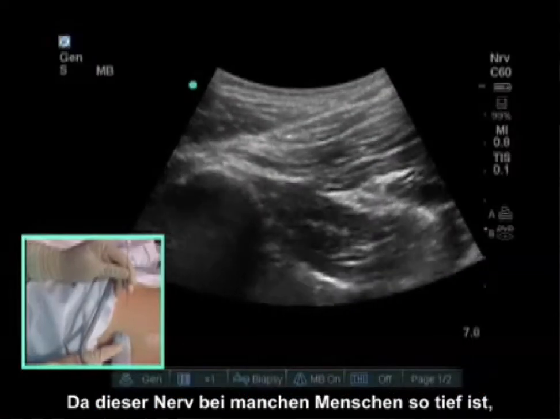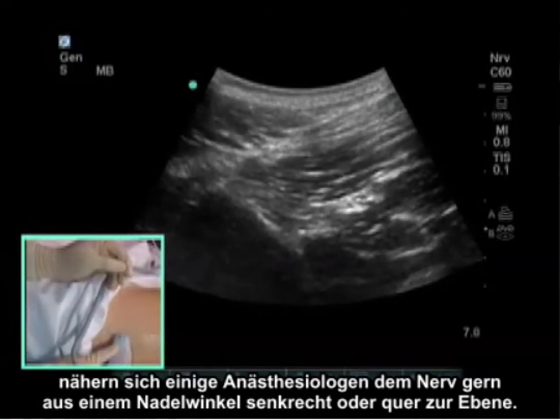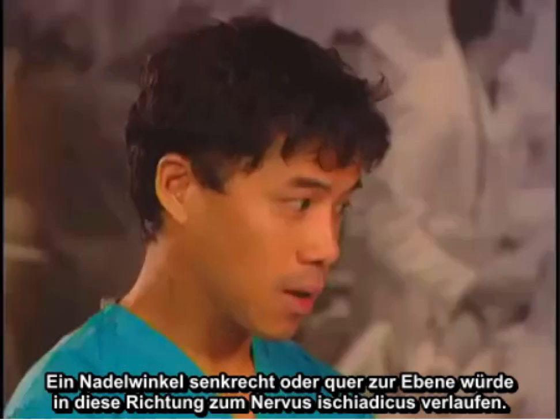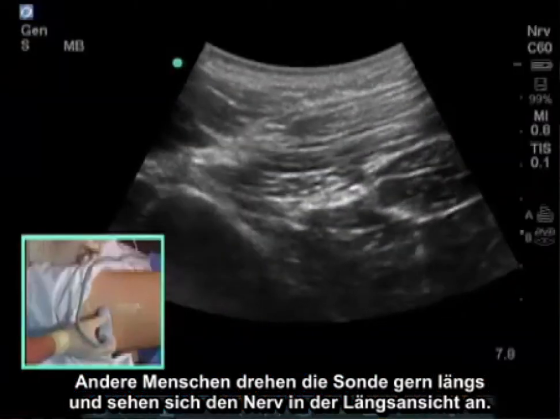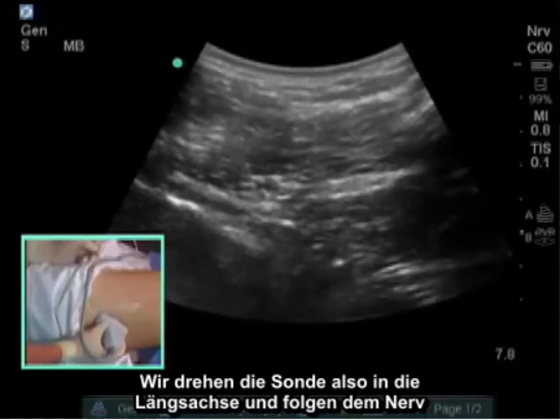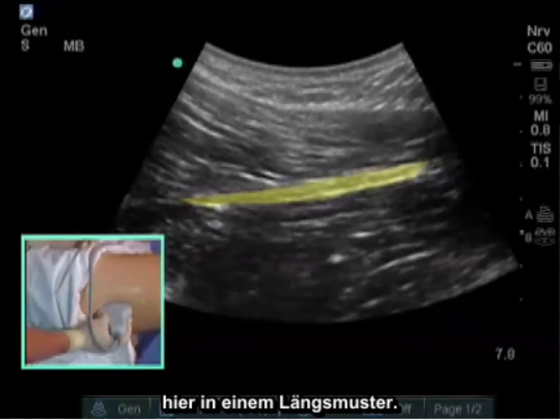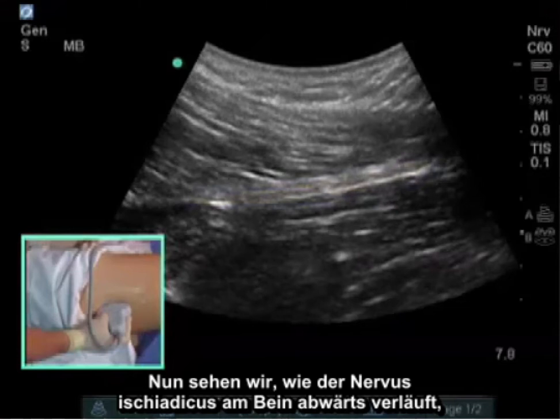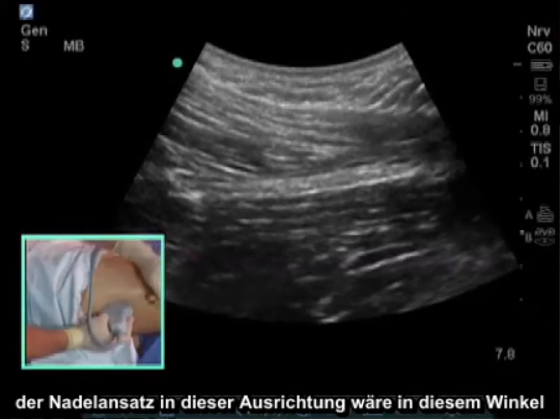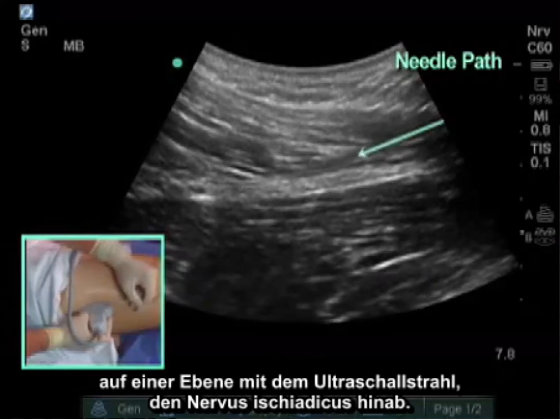Because this nerve is so deep in some patients, some anesthesiologists like to approach it from an out-of-plane needle angle, in this direction to the sciatic nerve. Others like to turn the probe in a longitudinal direction and see the nerve in long axis. Here we are turning the probe to the long axis and following that nerve in a longitudinal pattern, so now we see the sciatic nerve going down the leg. The needle approach in this orientation would be in-plane down to the sciatic nerve.